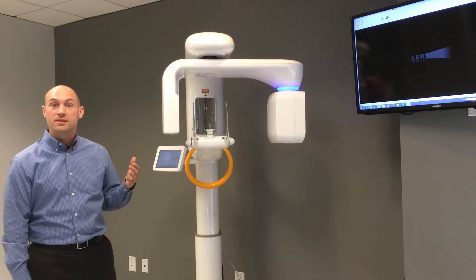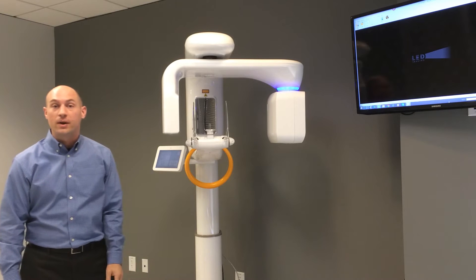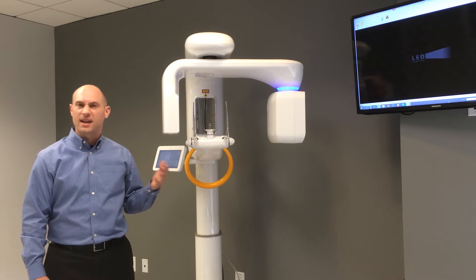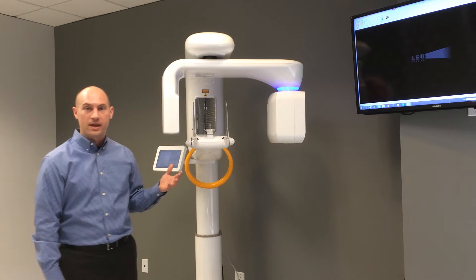Some of the major components of the hardware include the X-ray generator side, which above that has a blue LED indicating that the machine is in a standby mode. As we cover more of the hardware, I'll explain some of the different options that you have with that LED.